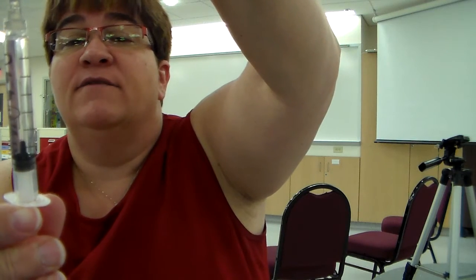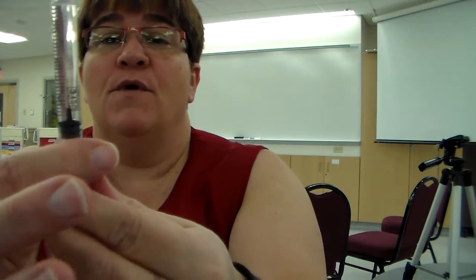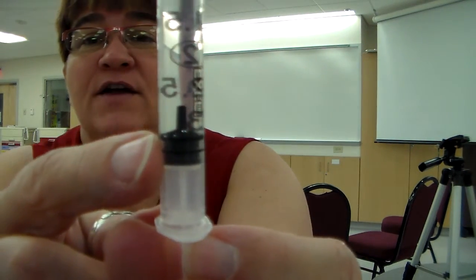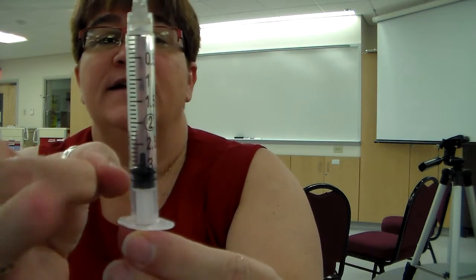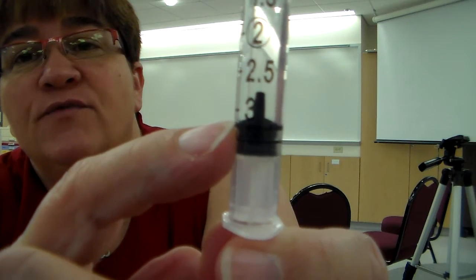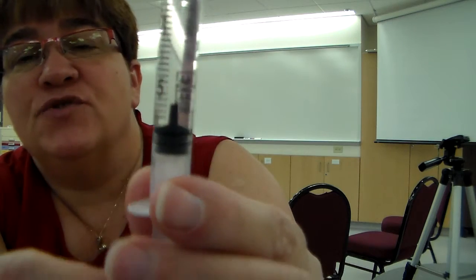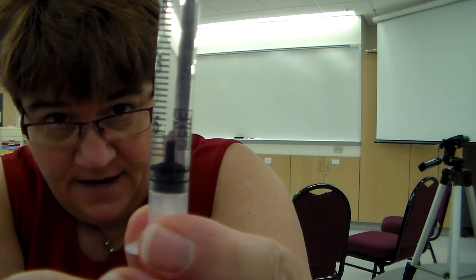Okay, so we have the medicine in there. We've withdrawn 3 milliliters, right? Well, we think it is 3 milliliters of medicine, okay? So I notice I have a little bubble in there. Can you see it? Okay, you're going to tap it. Make sure you get all those bubbles out of there. And then you're going to look to see, is that plunger really on 3? No, it's not. So I'm going to make sure that I'm eyeballing it, okay?